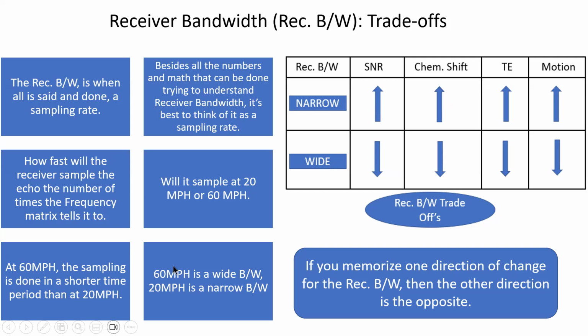Okay. Oh, got a chat here. Hold on. Alonda, no, they have their place, and I'll go over that. That's a good question, and I'll go over that. And mostly it's because of signal to noise and TE.